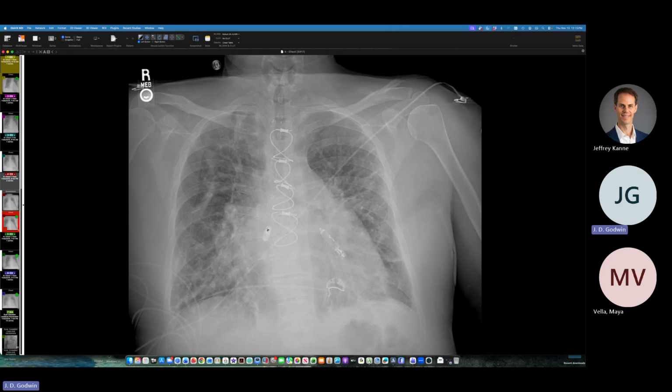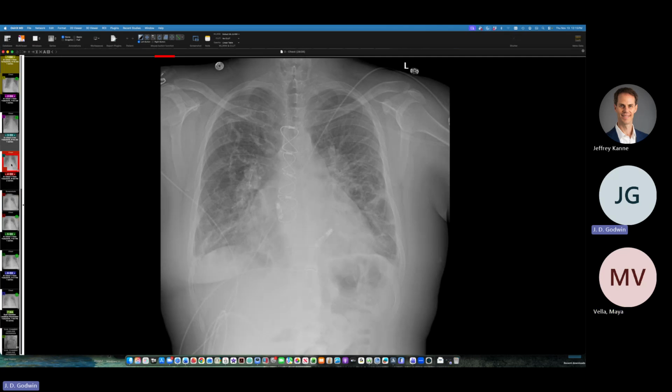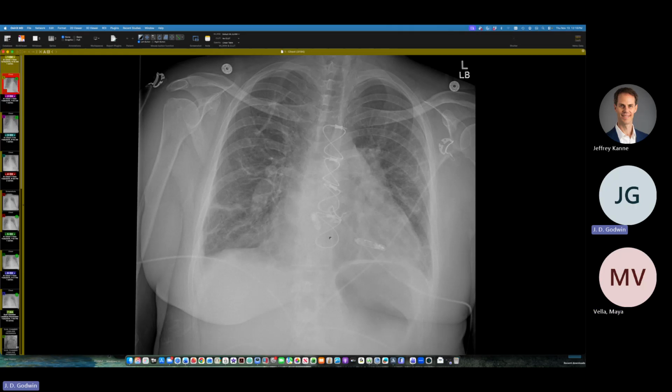Sometimes I think they actually put these near the sinoatrial node. I saw one of these things at the top of what seemed to be where the cava was joining the right atrium. I don't have a CT on this one to know what they did there, but I think they can put these near a sinoatrial node. Okay, and here it is near the end. So I think they went in and restabilized this thing, because I don't think you want it swinging around that much. It might dislodge. So this seemed to be a bit unstable there.